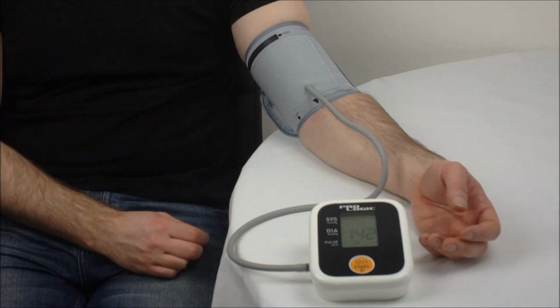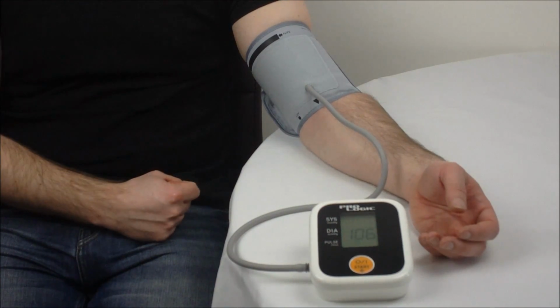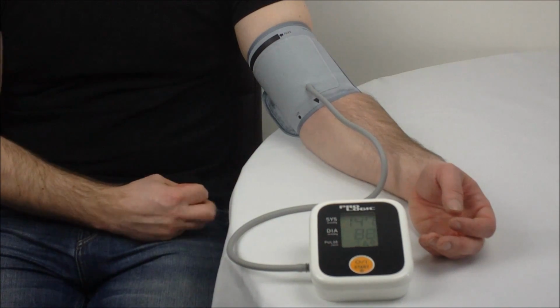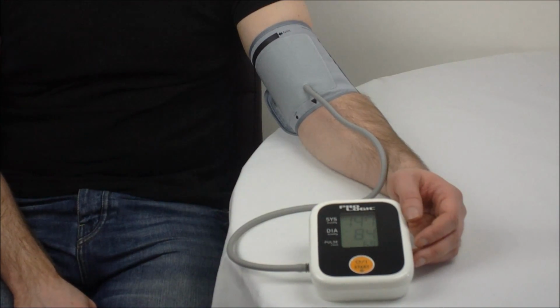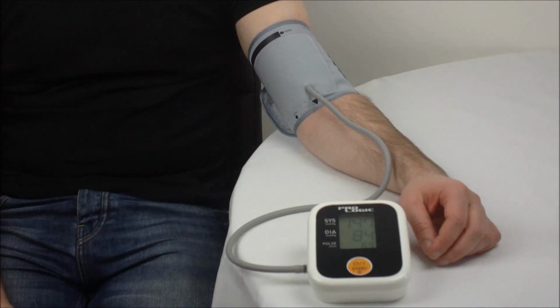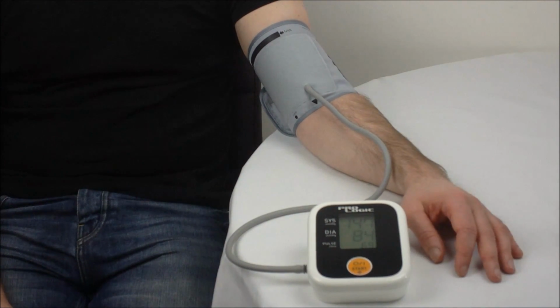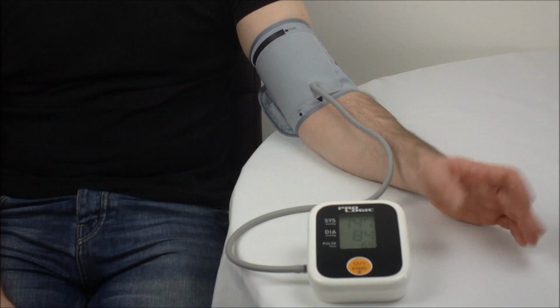So it's very important that your blood pressure is taken under the same conditions each time that you do it. So a one-off reading that says you have high blood pressure doesn't necessarily mean you will have high blood pressure. It just means at that moment in time your blood pressure was a bit high. So what you want to do is probably monitor your blood pressure over a few different days, maybe weeks, to see if it's consistently high or not. Okay, so once you've got your final blood pressure measurement, write it down and then go to the website where you can enter all three results and work out whether that is a high blood pressure. Like I say though, you need to do this a few times over the course of a week or a couple of weeks to make sure that you're getting consistent readings.